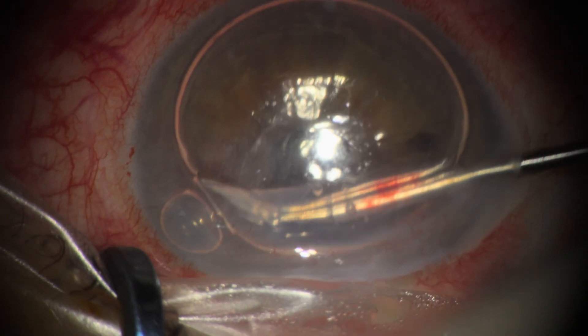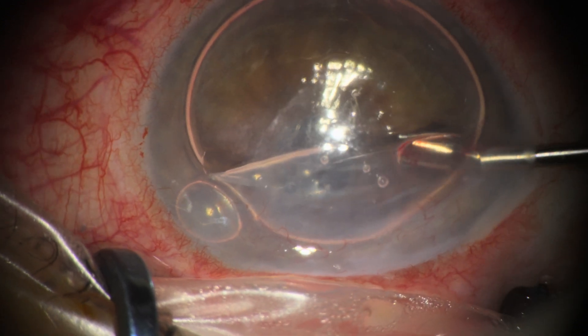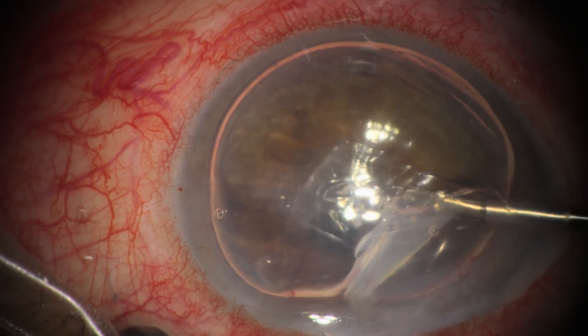We can see that the membrane is quite thick and has neovessels in it that bleed when the membrane is peeled.